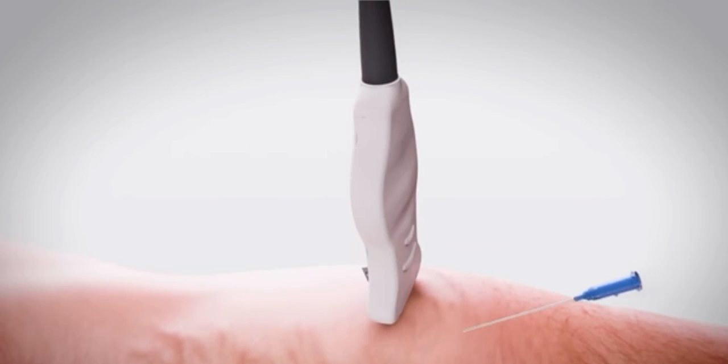The procedure is always performed under ultrasound guidance, giving the doctor a live view of your vein for accuracy and safety at all times.